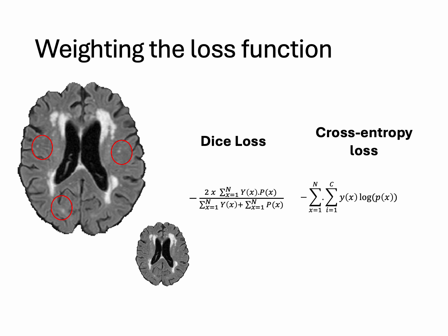Whereas these small lesions, our recent study has shown, have more association with vascular abnormalities like stroke and other cerebrovascular diseases. So it's equally important to identify these lesions as well, where most of the segmentation algorithms fail. So we wanted to get a high segmentation performance in the deep lesions as well. So we slightly modify our loss functions, especially the cross entropy loss.